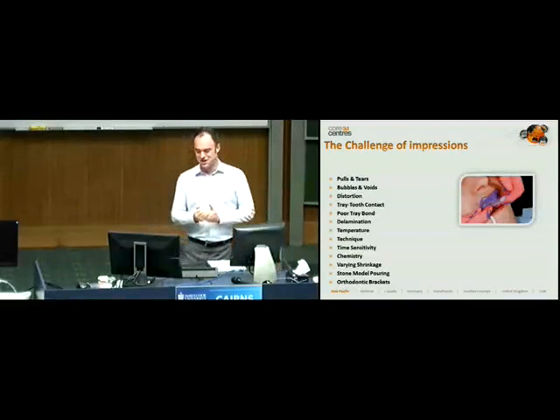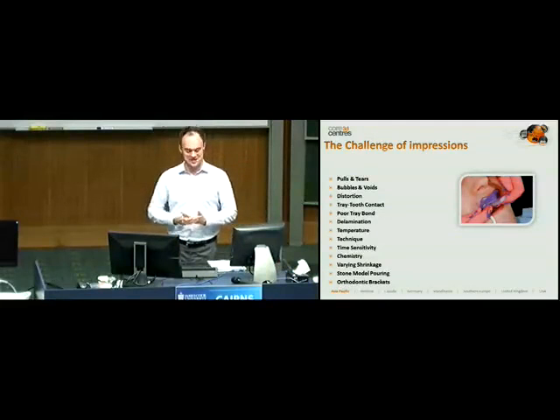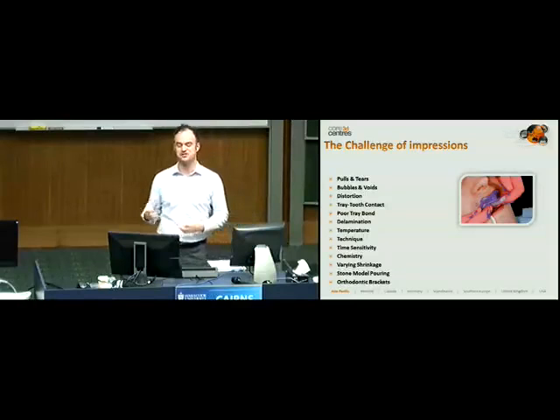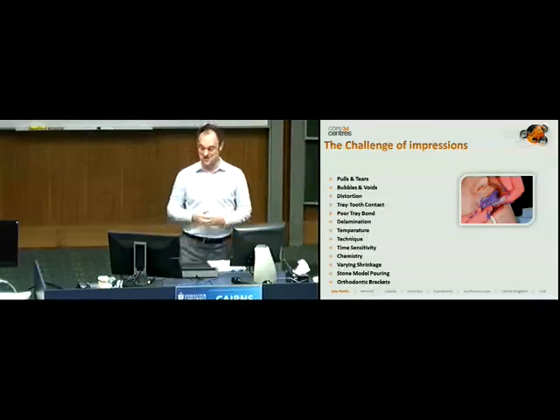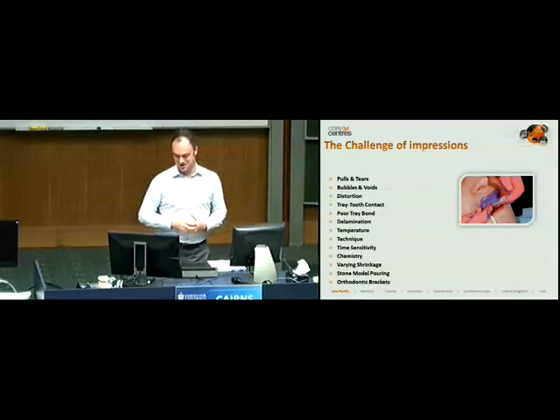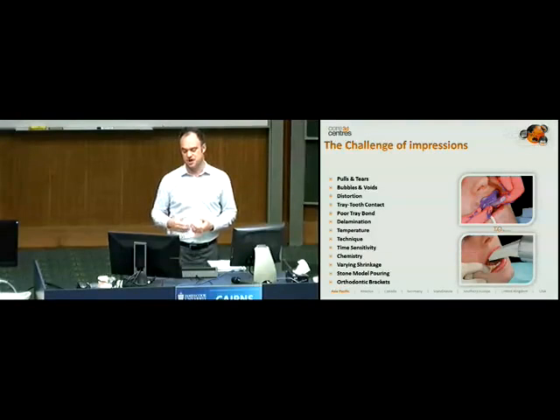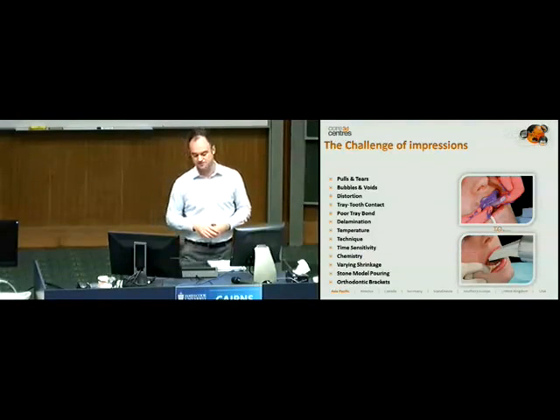This image you see on your right was actually at a dental show, and they were challenging dentists to take an impression as fast as you could take an intraoral scan. And as you can see, they weren't too worried about technique. I think it was about speed. But what you can do is start to think about moving from conventional impressions to the scan, which you see in the bottom right hand of the screen.